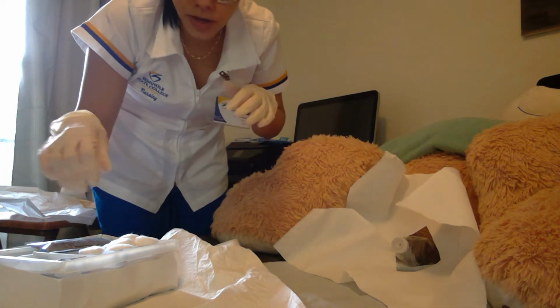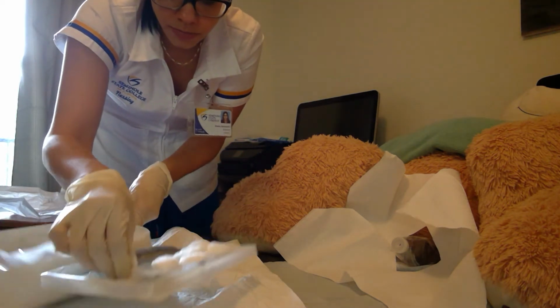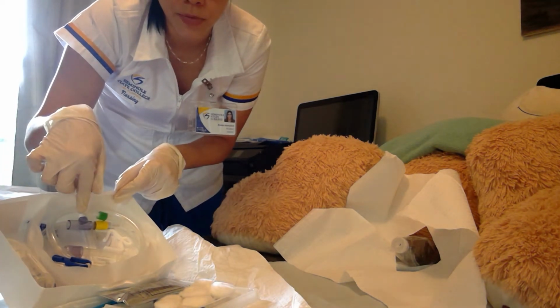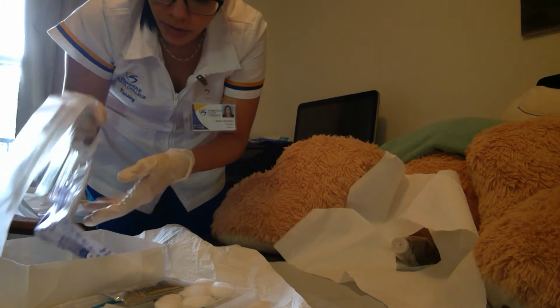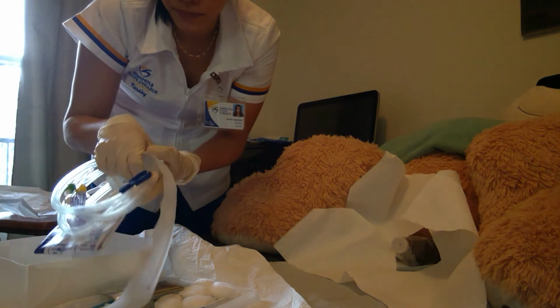Okay, so now I'm gonna open my tray here, and I just make sure that I have all my necessary equipment. I have my Foley bag right here, which I am going to make sure that it's clamped. I can touch it, I can open it, and it's closed and clamped.